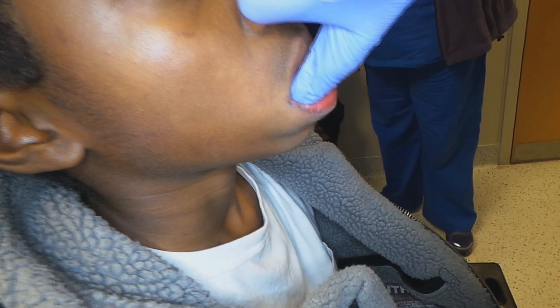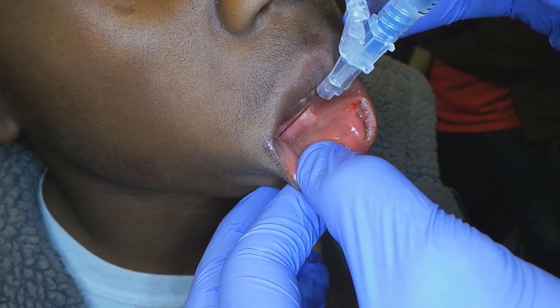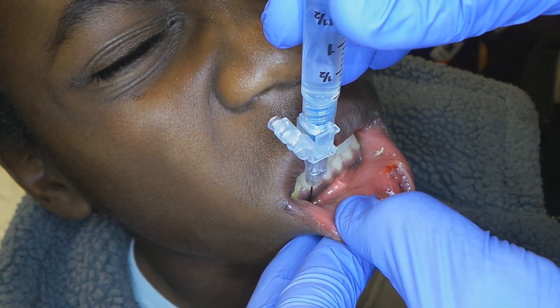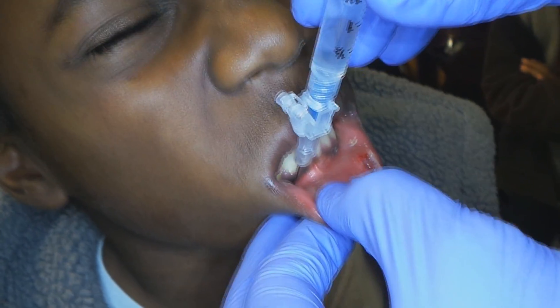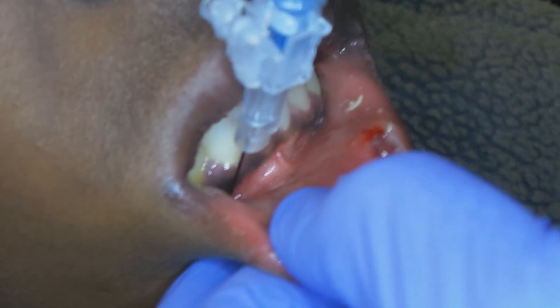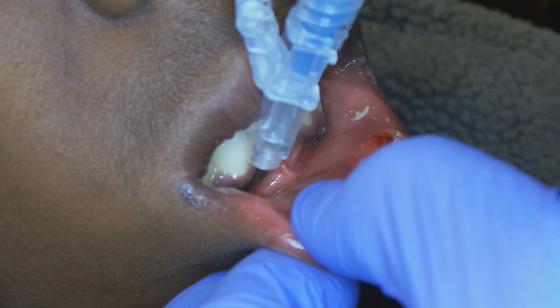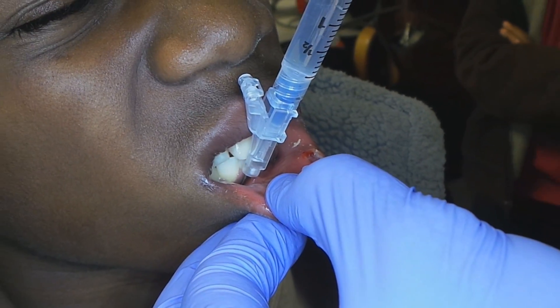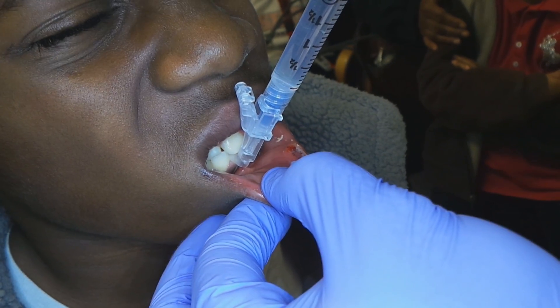As you're localizing that, you're feeling it internally, but then you also felt it externally too. We're just going to poke in. At the same time, I'm feeling from the outside to see where my needle tip is. You don't want to inject into the foramen itself because you don't want to cause neurovascular damage by putting too much pressure inside the foramen. So I'm just above where I felt previously, and I'm going to inject one to two cc's, nice and slow. It's going to sting a little bit. I can feel the wheal building under my finger — right there at the foramen.